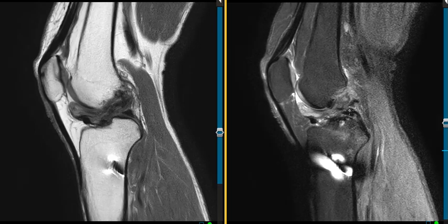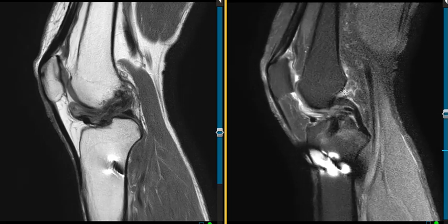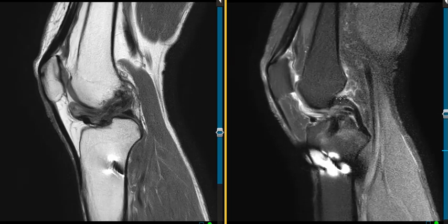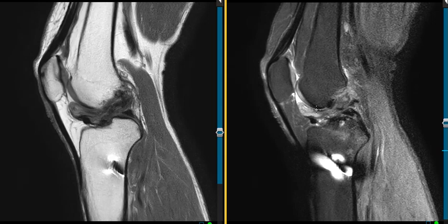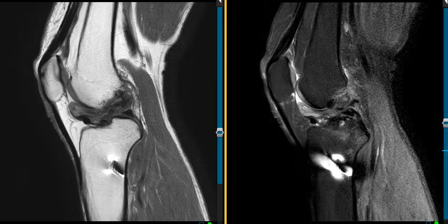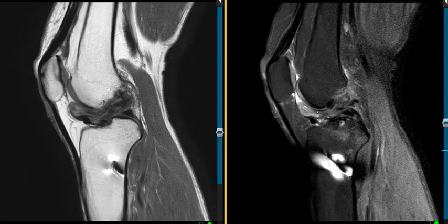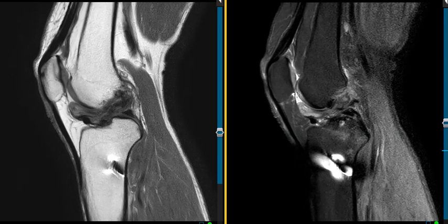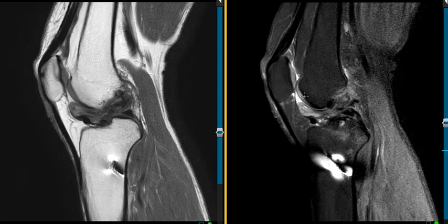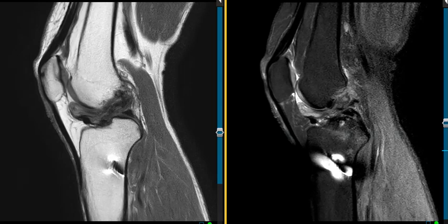The other finding, which is why I'm showing the video, is related to an area of abnormal signal in front of the graft. So the graft comes obliquely through here, it looks abnormal, and in front we see what looks like a tongue-like projection of this intermediate signal right here. Above it is a little triangle of fluid — this is fluid in the anterior knee joint.